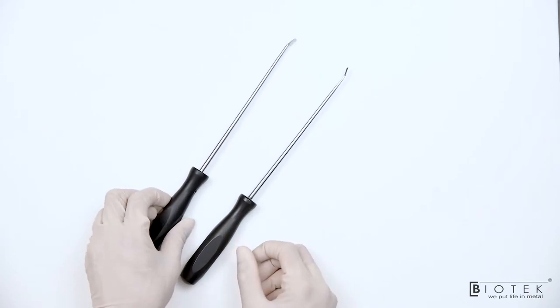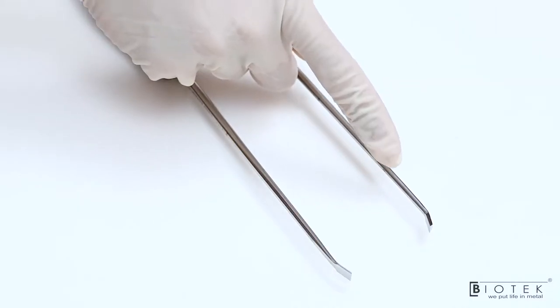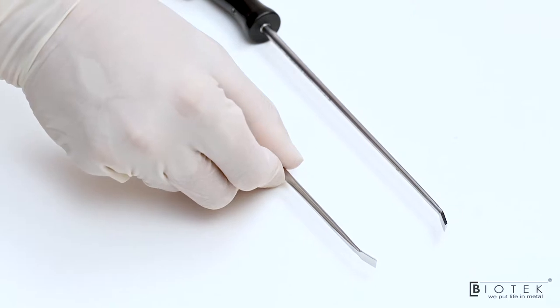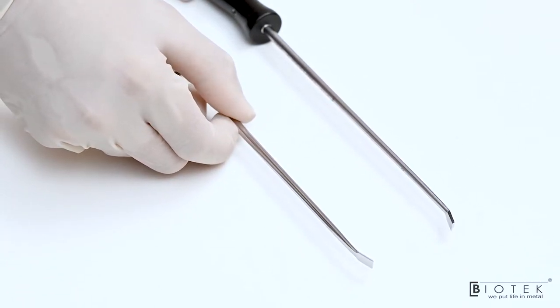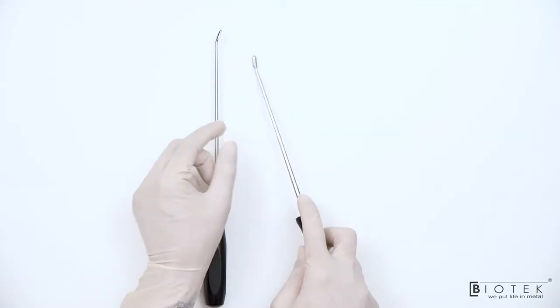These are Tissue Elevators. This is Downward and this is Upward Elevator. It is used to elevate the soft tissue off the bone for better mobilization.